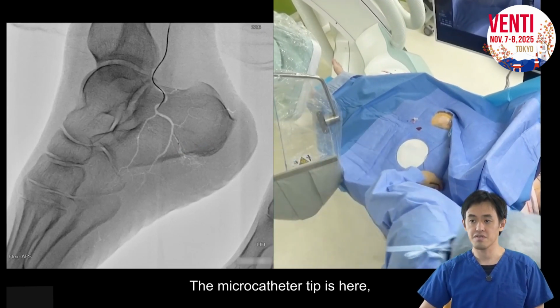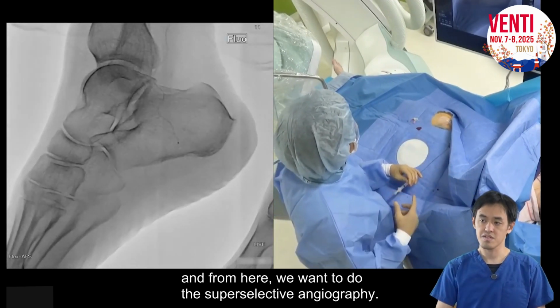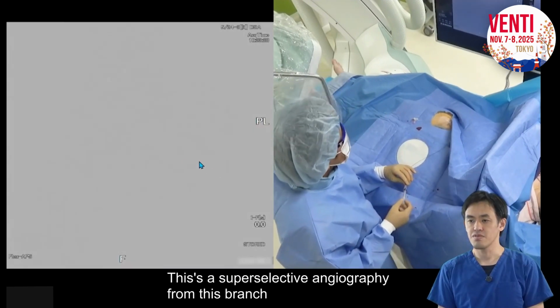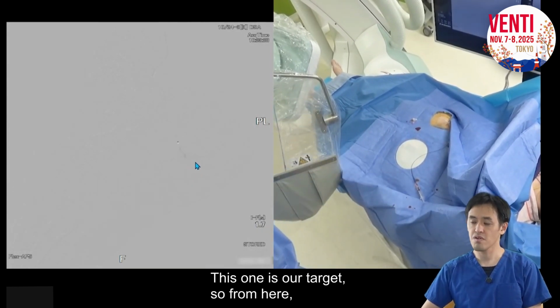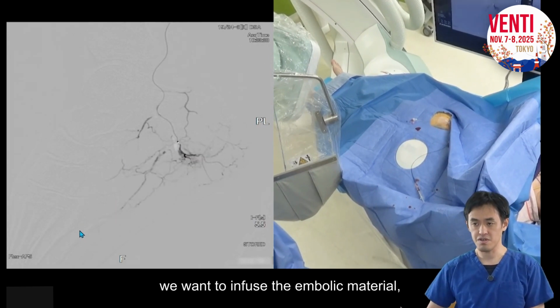Here, the microcatheter tip is here, and from here we want to do the super selective angiography. This is a super selective angiography from this branch. Okay, so we can see the brush here. This one is our target. So from here, we want to infuse the embolic material.